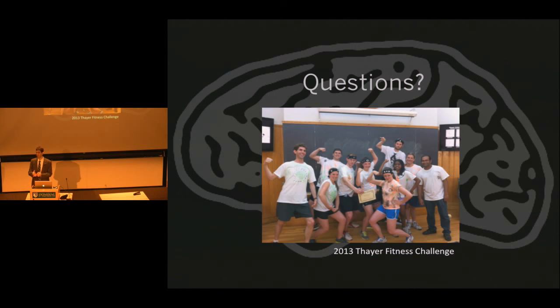Now, an individual who's looking to get away from their mouse and just navigate their computer might not want their skull opened up. But you might tolerate, say, an EEG cap. Now, we have right now a lot of advancements in wireless EEG, where you could go out and buy for a few $100 an EEG system that would measure a few channels. Whether it gives you the resolution you need to be productive on your computer is still a little hazy, but we're getting closer. So really, we'd like to be a little bit finer on the resolution, better sensitivity, lower noise than anything available now. I believe that we're going to get there with the combination of the magnetics imaging at multiple scale. I think that's going to really move us forward.